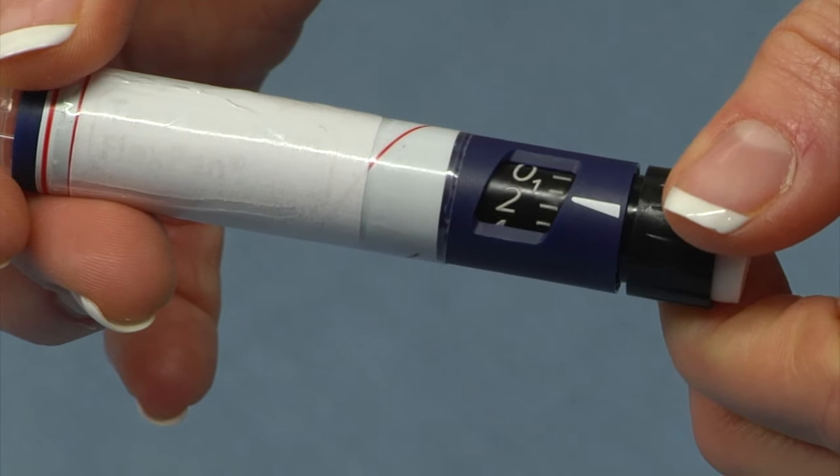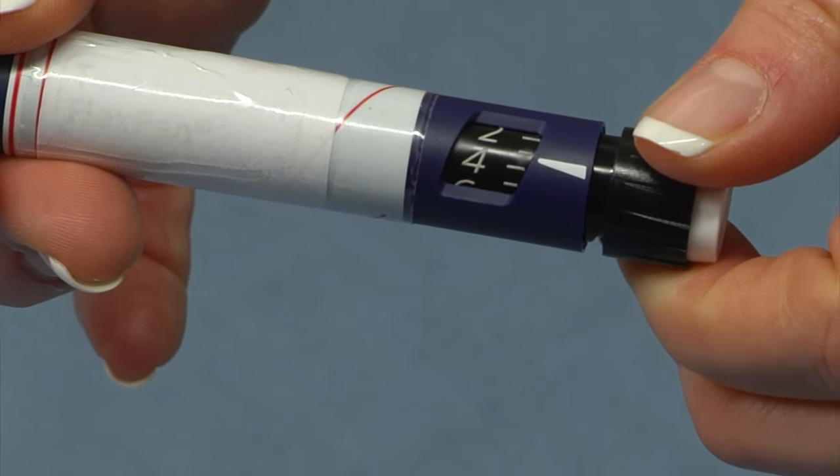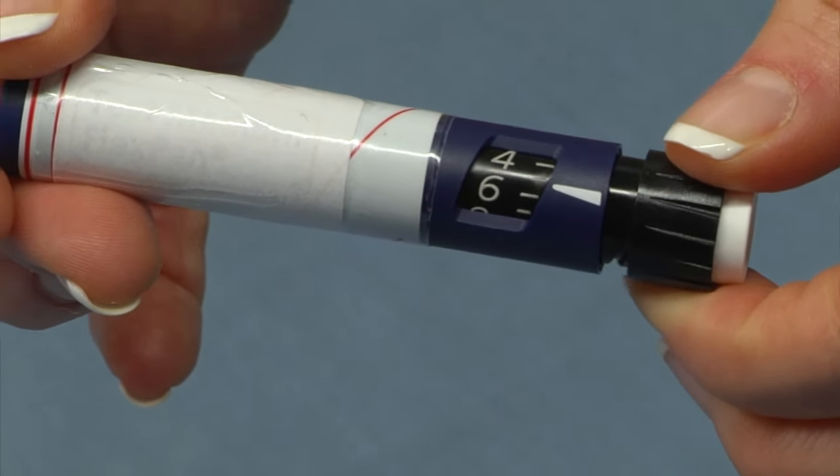Next you're going to dial the dose that's been prescribed for you. For example, if five units is my dose, I'll dial to the mark right between the four and the six, and I'm ready to give it.